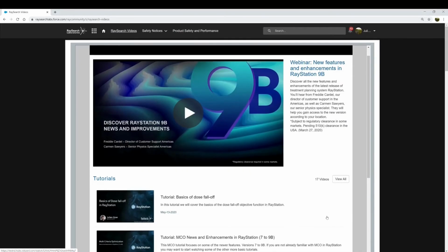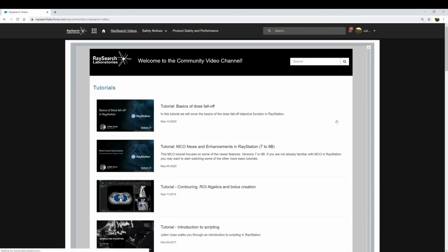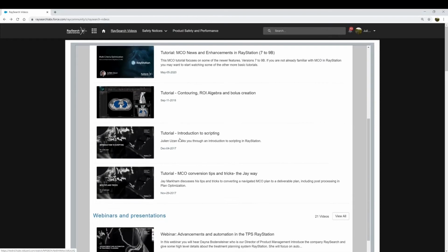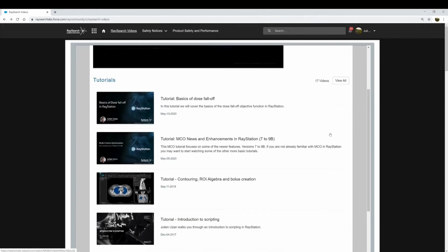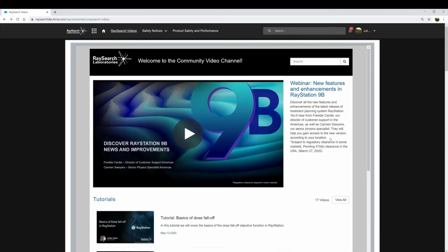In the RaySearch video section, RaySearch support staff publish videos that cover various topics in the form of 5 to 10 minute tutorials or longer, more in-depth recorded webinars. We also systematically publish a video to present innovations in our latest software releases.